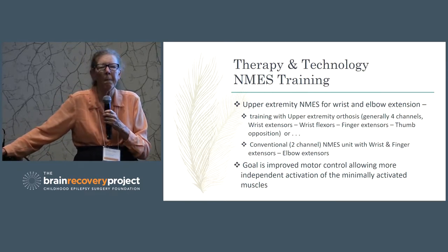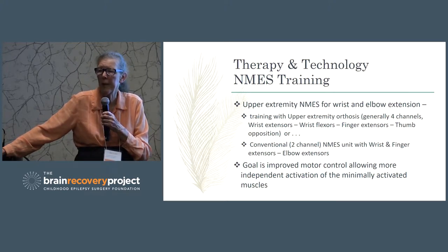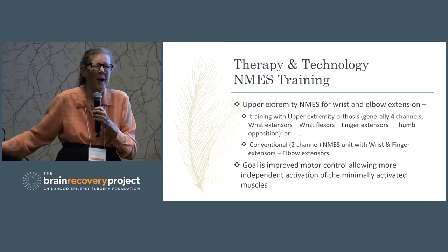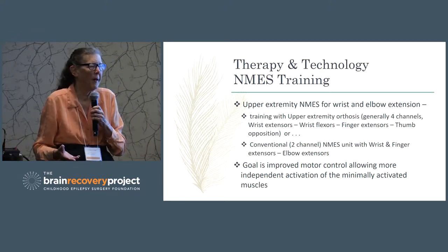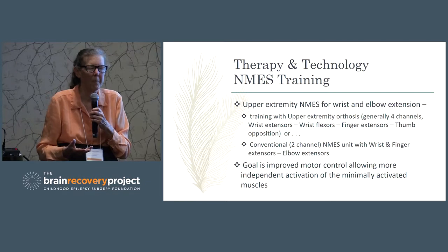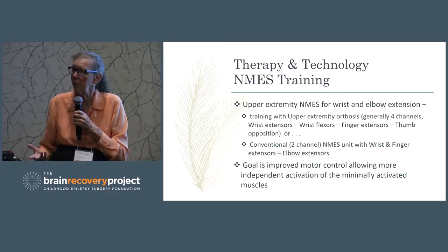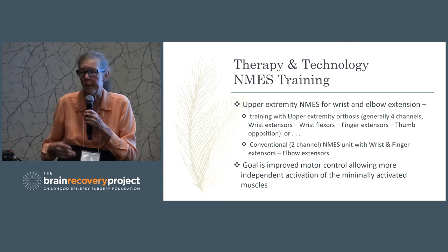When I have patients who have a need for it, I will have a stimulator sent home and they can use it maybe once or twice a week in order to allow the extremity to remain in a relaxed position and the hand be positioned more appropriately for function. Okay, so it's not a quick little, it's going to fix it in a minute, but it is something that you can keep working with, and as your child grows and they hit growth spurts, then you know from your other kids are awkward in their growth spurts, right? And your child with epilepsy is no different from that. So as they hit a growth spurt, you might need to use the stimulation more intensively again for a short time, and then move them off of it again until they hit the next growth spurt, okay?